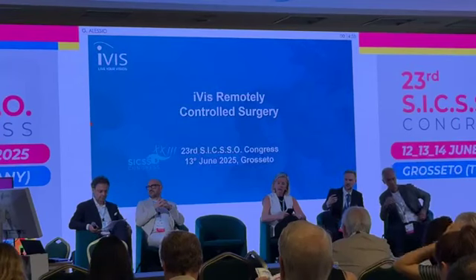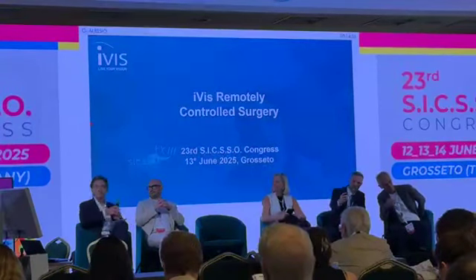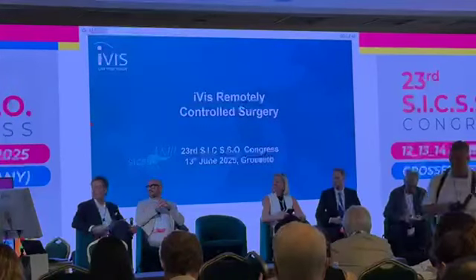And now we are starting a cross-linking plus by internet, by 5G, from here to my operating room in Bari. The patient is there and I am here. I do not need to wash or prepare, I can operate myself. So I think that sounds great. Well, that's all operating from home.